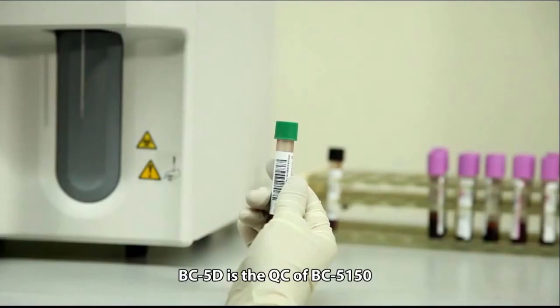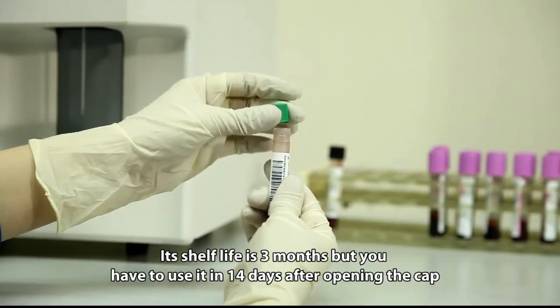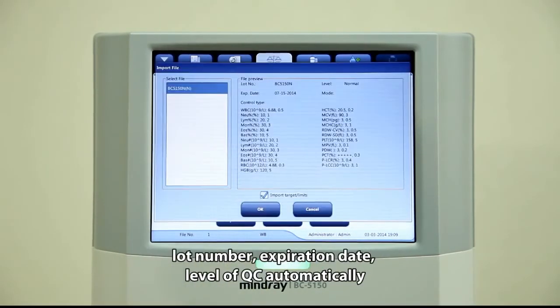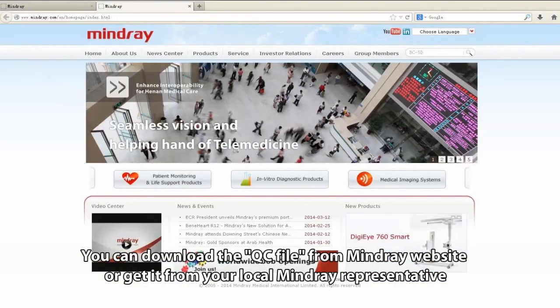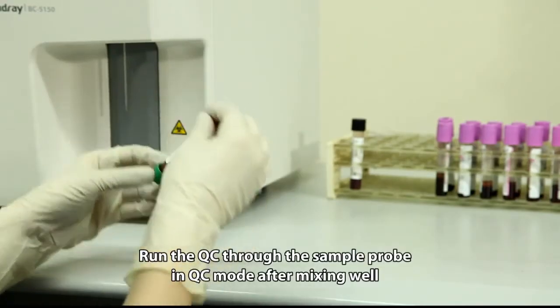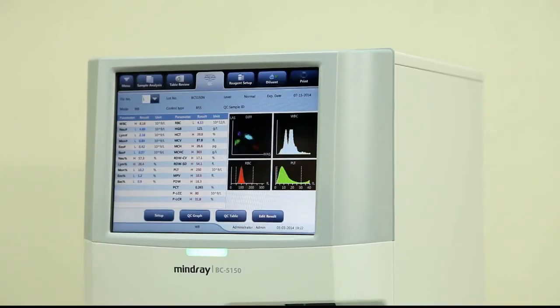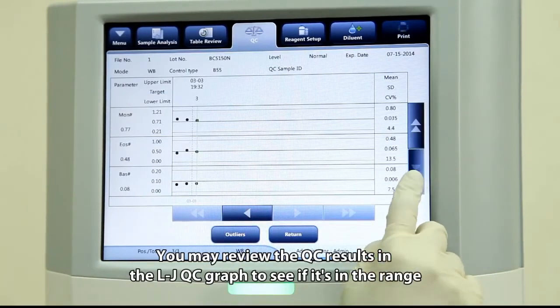BC5D is the QC material for the BC5150. Its shelf life is three months, but it must be used within 14 days after opening. By importing the QC file, the BC5150 can automatically load the target value, lot number, expiration date, and QC level. You can download the QC file from the Mindray website or get it from your local Mindray representative. Run the QC through the sample probe in QC mode after mixing well. Review QC results in the LJ QC graph to see if they are within range.